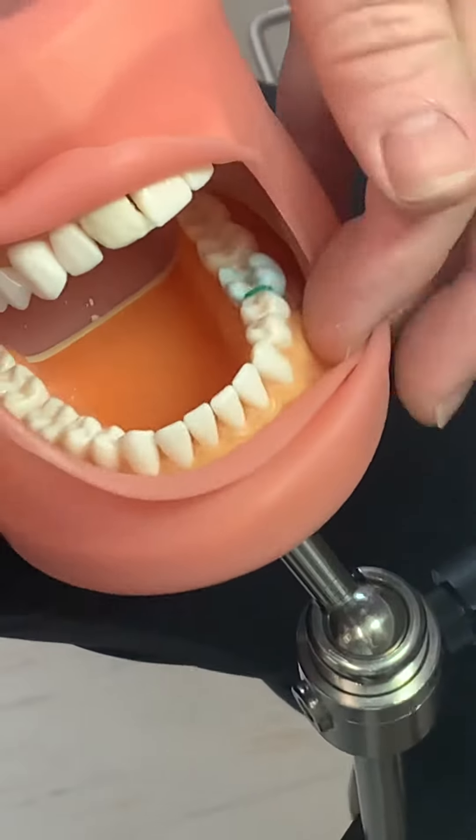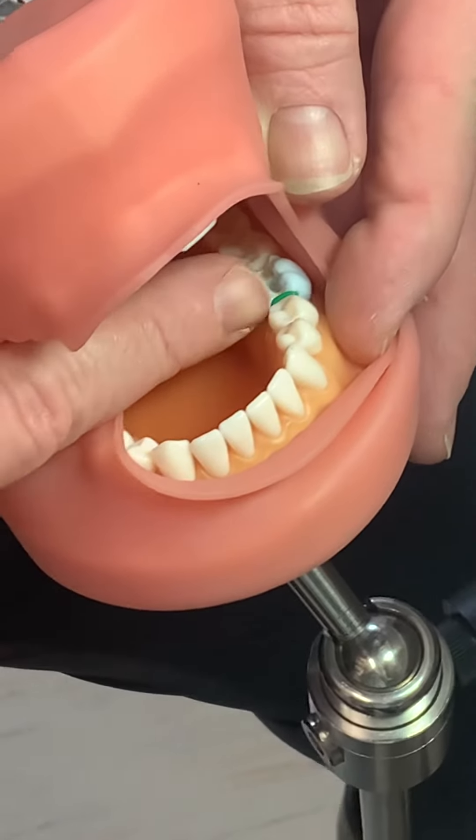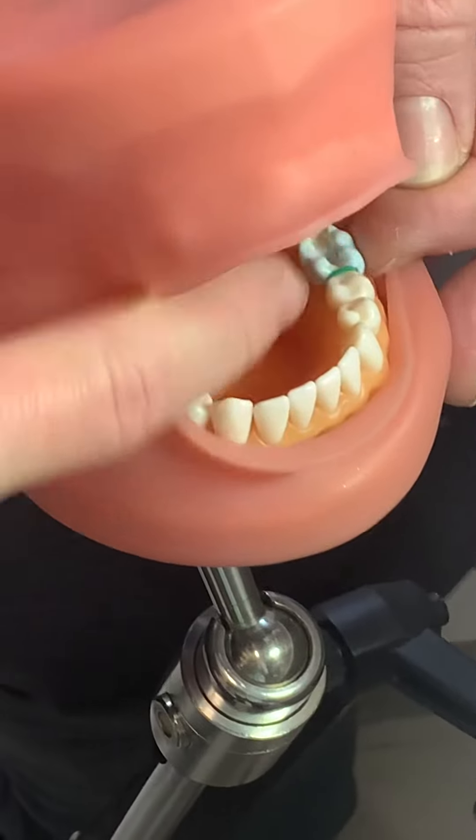There we go, so there's one side. Do you see how it's not down below the gingiva? It's not impinging on the gingiva, but it's not above the occlusal surface either. So now we're going to do the distal.